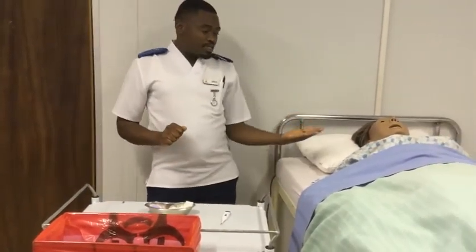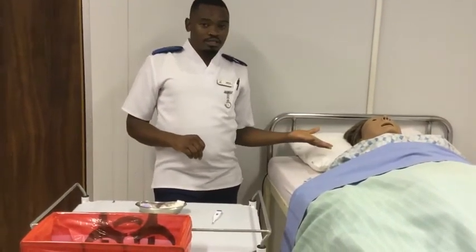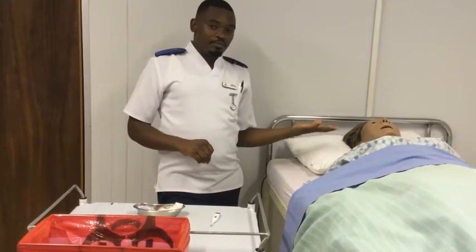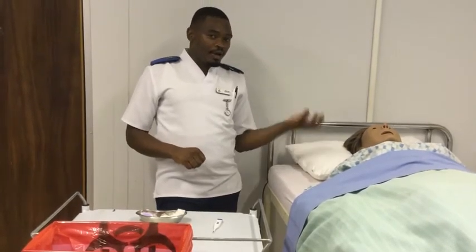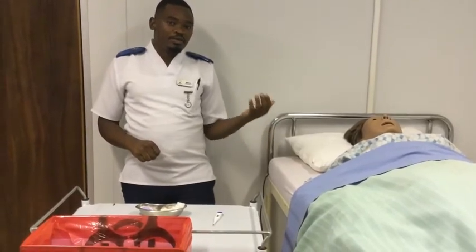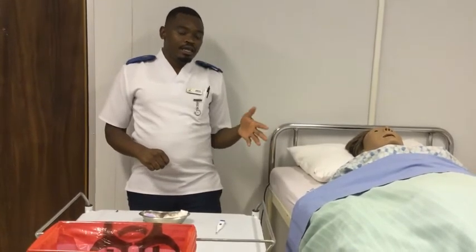Here is my patient. This is Mesusi, who seems to be unconscious because she can't respond to either pain, calling her name, or anything — so she is somehow unconscious. However, we are going to perform the skill and I will maintain communication with her throughout the procedure.